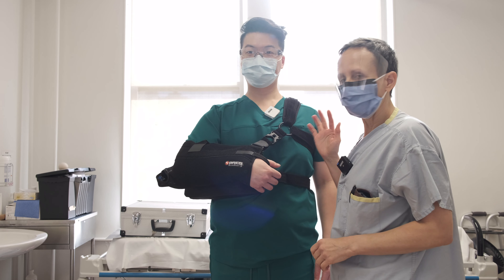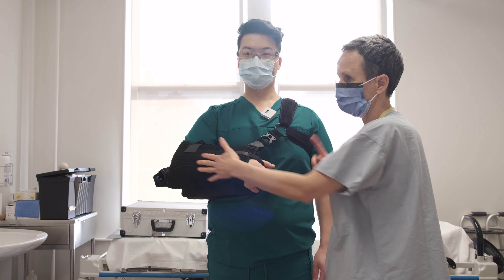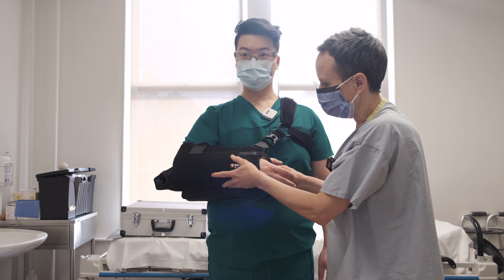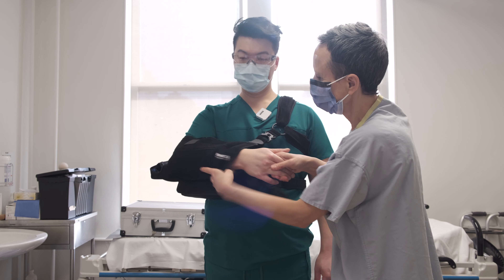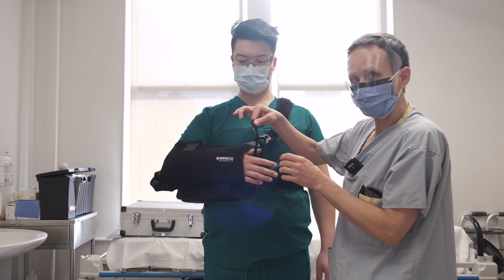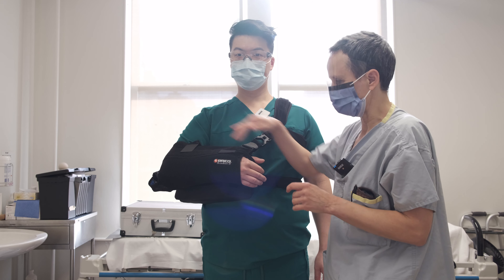It's very important to make sure all these straps are set to your size because you want really good support on your operated shoulder. Check all the positions — you want your arm in the sling fully supported. Those slings like to travel backwards, so you don't want to end up with the sling shifted. Just pull it forward, with your elbow nice in the back of the sling. There is a little strap you can put on to support your thumb, which also helps anchor the sling so it doesn't travel backwards.